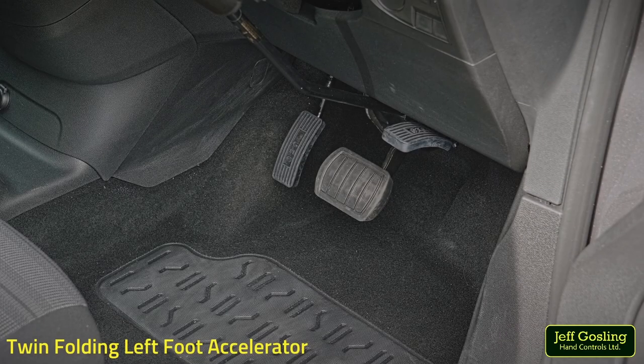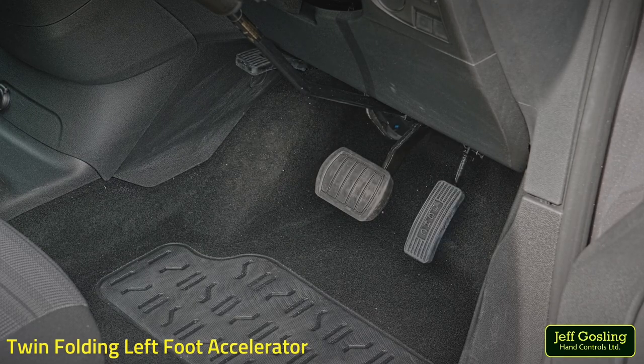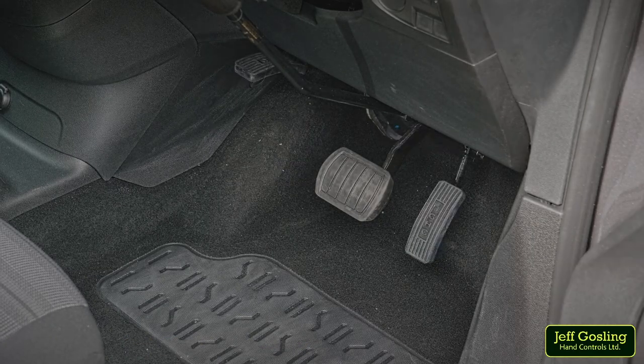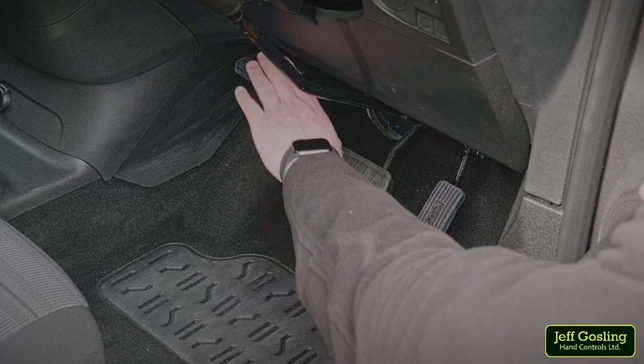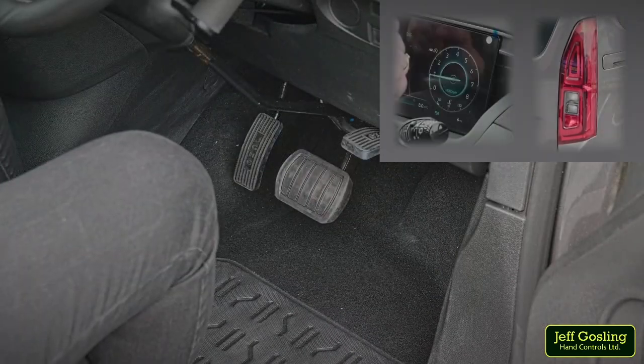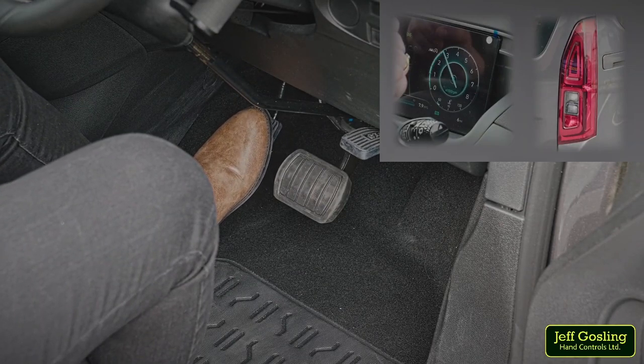The Jeff Gosling twin folding left foot accelerator mechanically replicates the vehicle's standard right hand side accelerator pedal with an additional pedal to the left side of the brake pedal. The ability to transfer between left and right pedals allows the vehicle to be converted easily to drive with either left or right foot as required by the driver. To drive with your left foot, simply pull down the left pedal. The action will automatically fold up the right pedal, enabling you to use your left foot to make the vehicle accelerate.